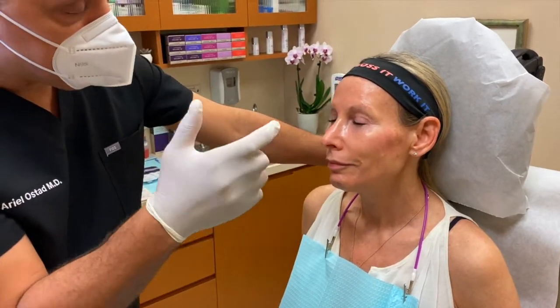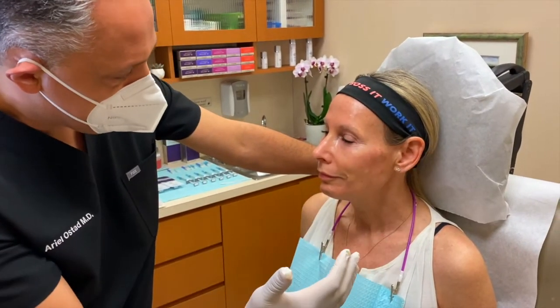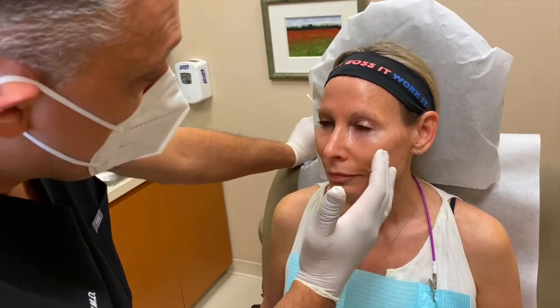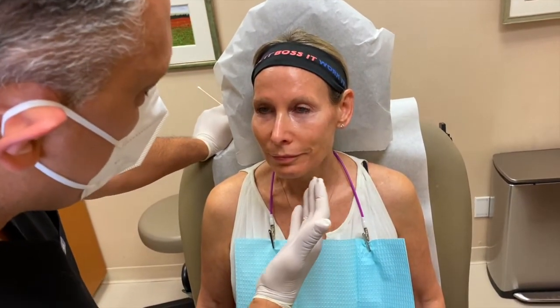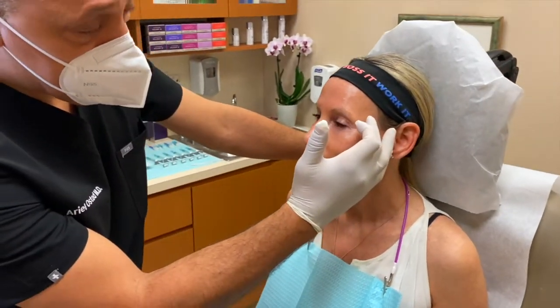What's really important in your situation, which we don't necessarily see all the time, is that you unfortunately have a lot of hollowing in your temples. Even the temples play an important part in supporting our cheekbone and our jawline. Once I inject this temple, not only proportionally will you look even better, but you will see how your jawline will elevate. So what we're going to be doing today is injecting her temples.